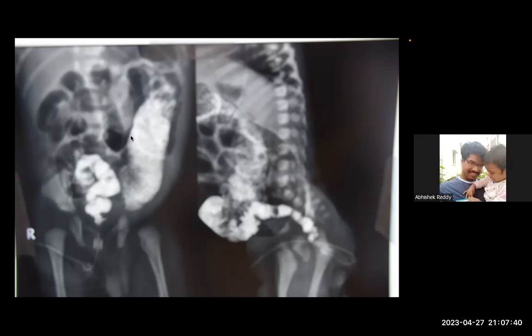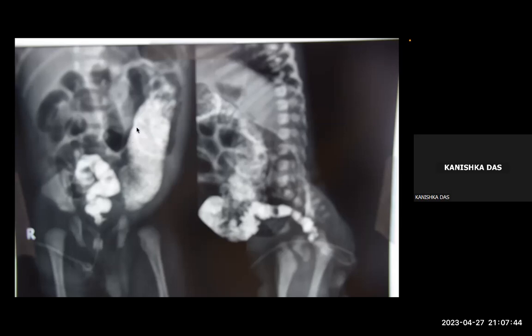Suggest hypertrophy. Yes, it says that you see these sorts of mucosal changes when there is early enterocolitis. If you wait long enough, that will progress to enterocolitis. So we are really scared of those changes rather than just a simple mucosa like this. These floccular shadows are something to be wary about. So how would you proceed in this child?